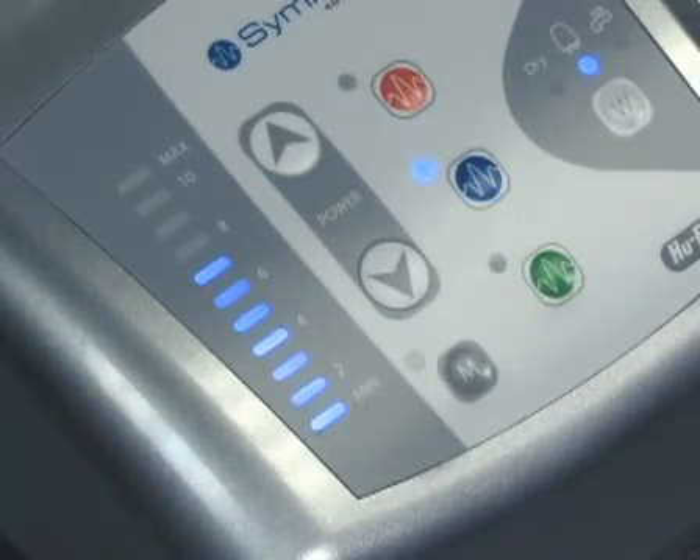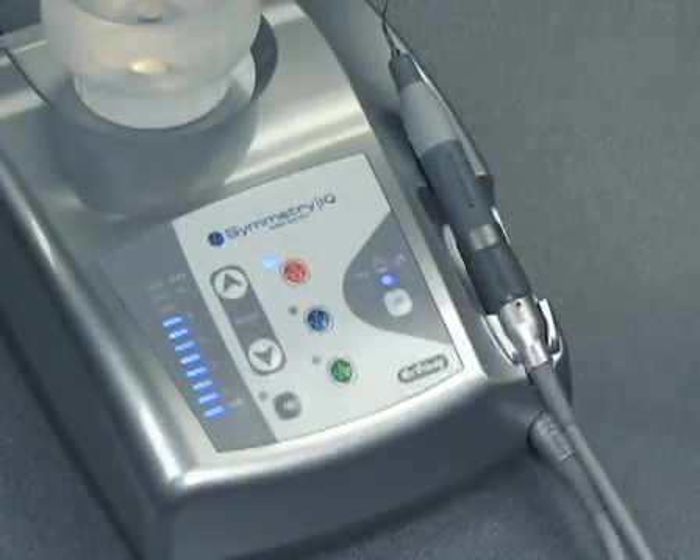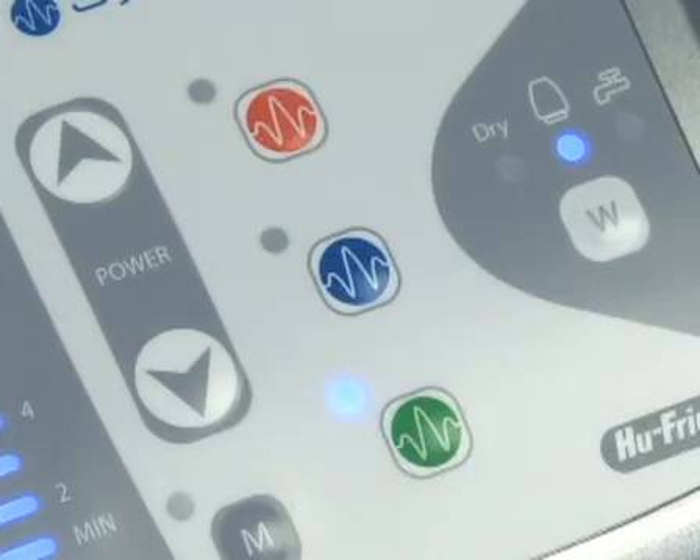Turn on the power switch on the side of the control unit. The front panel will light up. Select the appropriate power mode for your procedure with the green, blue, and orange keys on the front panel.